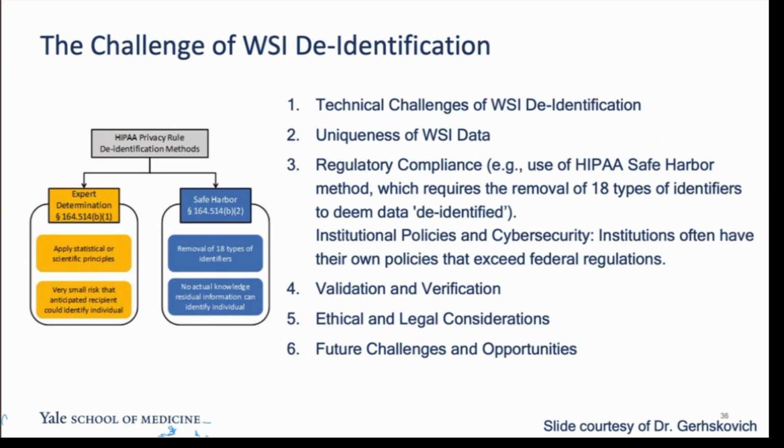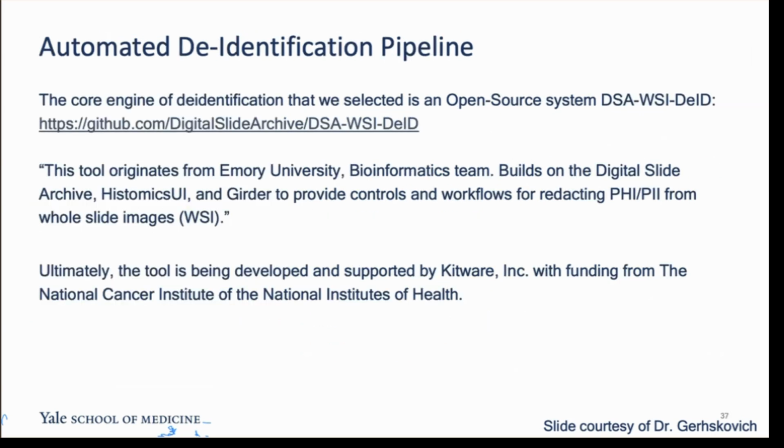What we would do instead was actually use a safe harbor approach, where basically all identifiers are stripped from the image. And in order to do so, we teamed up with the NCI, which is funding a tool that's being developed by a company called Kitware. It originated from the Department of Bioinformatics at Emory University.